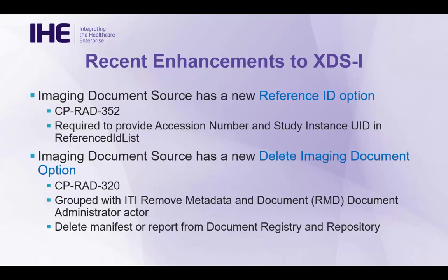The second major thing that we added is a new delete imaging document option. Previously, there was some high-level text that said if the study in your imaging document source has been deleted, somehow you need to delete the study in the registry or the repository, but it never mentioned how this was supposed to be done.